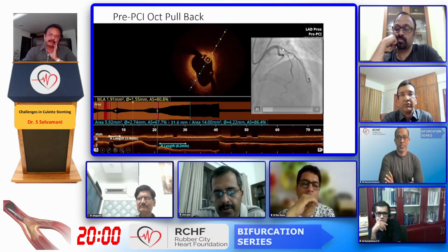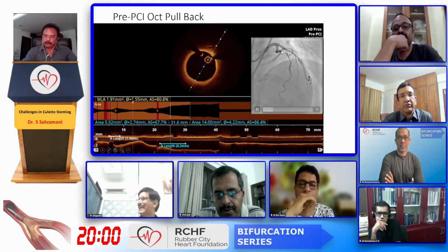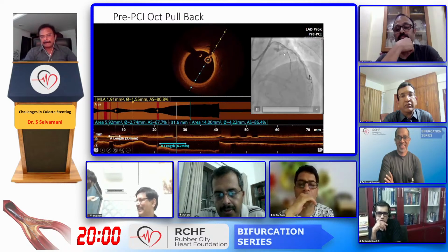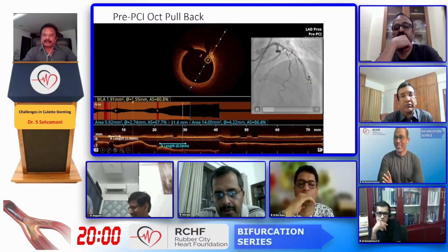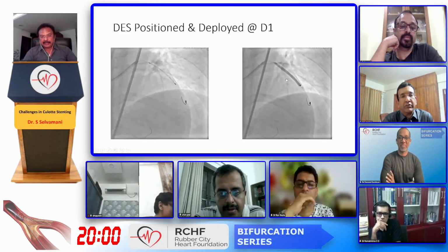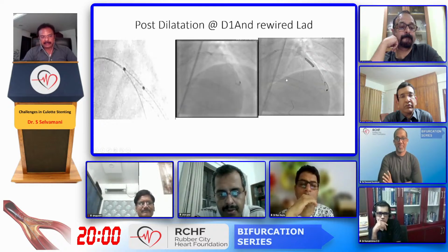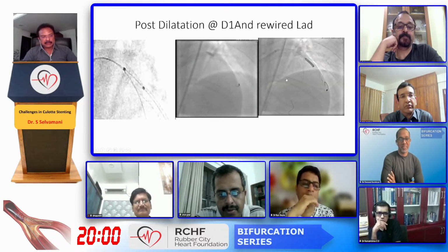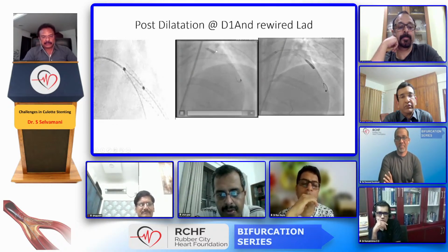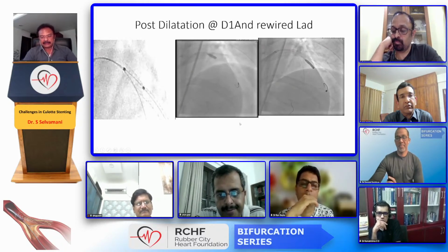Yes, definitely we can bring that 3 stent to 4.1, 4.2, you can do either. And with that idea, we went ahead and did this procedure. So I deployed the LAD to diagonal stent there, and it dilated very well. And I did a POT also there, used a 4-size balloon in the left LAD and dilated the stent there.